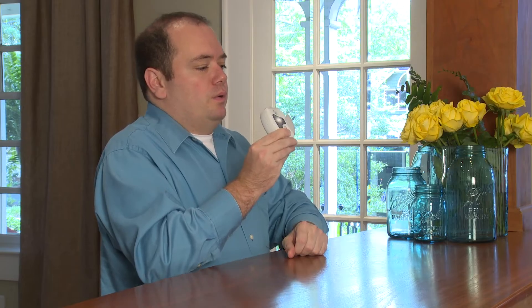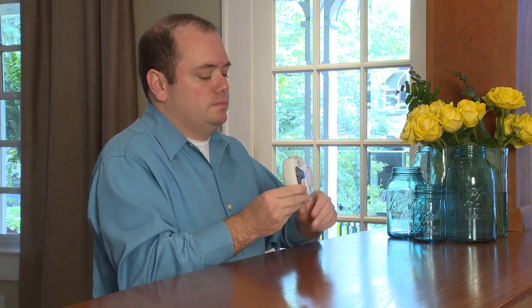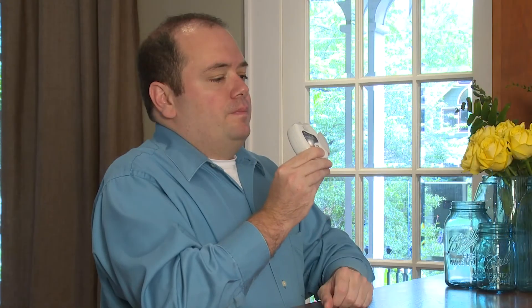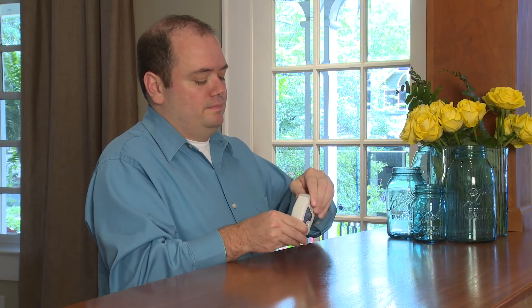You only need to breathe in one time. Make sure you do not block the air vents with your fingers. If you breathe in more than one time, you will not get more medicine. Hold your breath for five to ten seconds — this lets the medicine go deeper into your lungs.